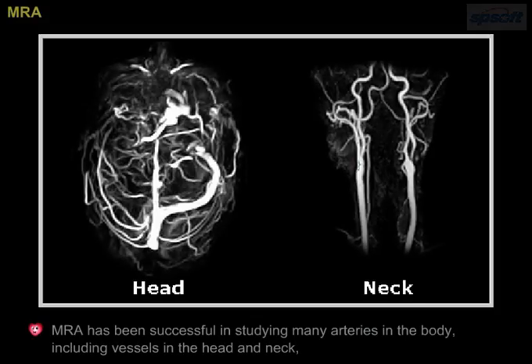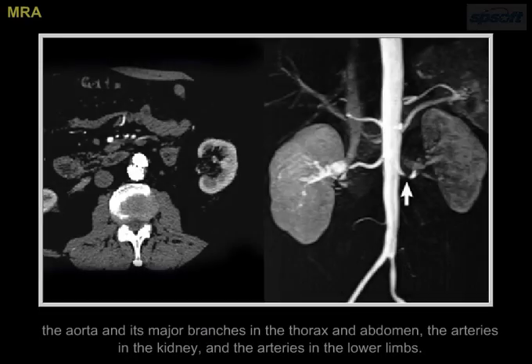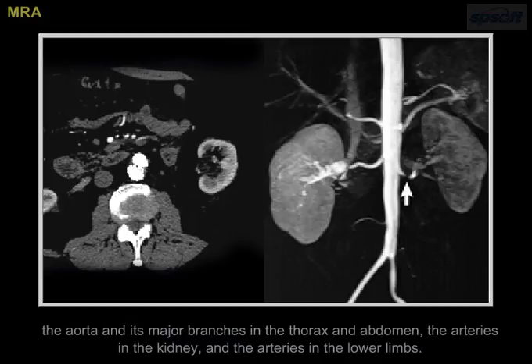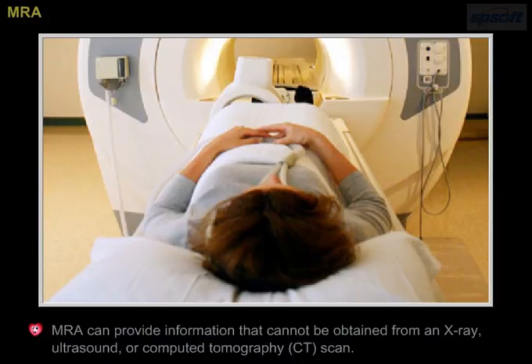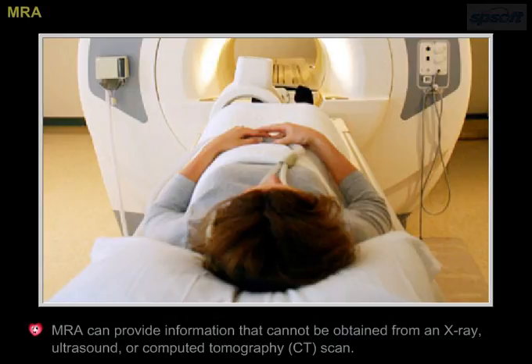MRA has been successful in studying many arteries in the body, including vessels in the head and neck, the aorta and its major branches in the thorax and abdomen, the arteries in the kidney, and the arteries in the lower limbs. MRA can provide information that cannot be obtained from any X-ray, ultrasound, or computerized tomographic CT scan.